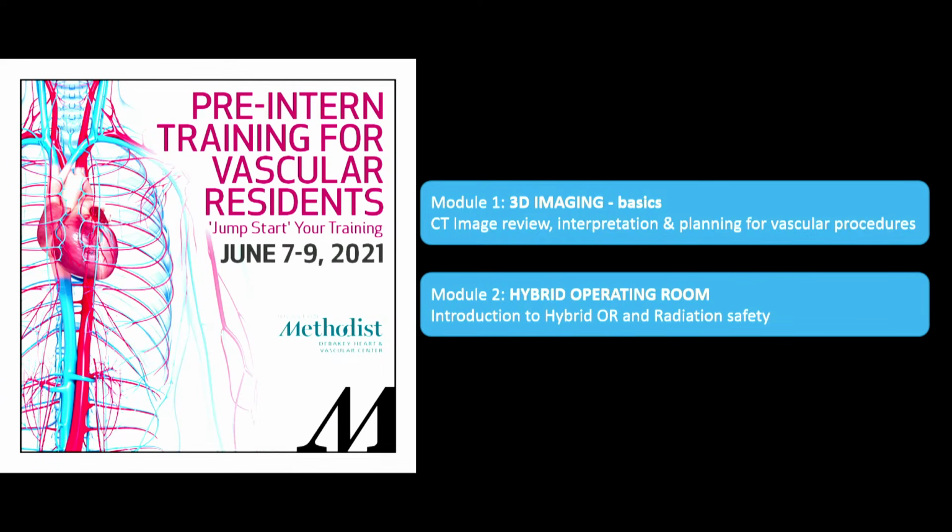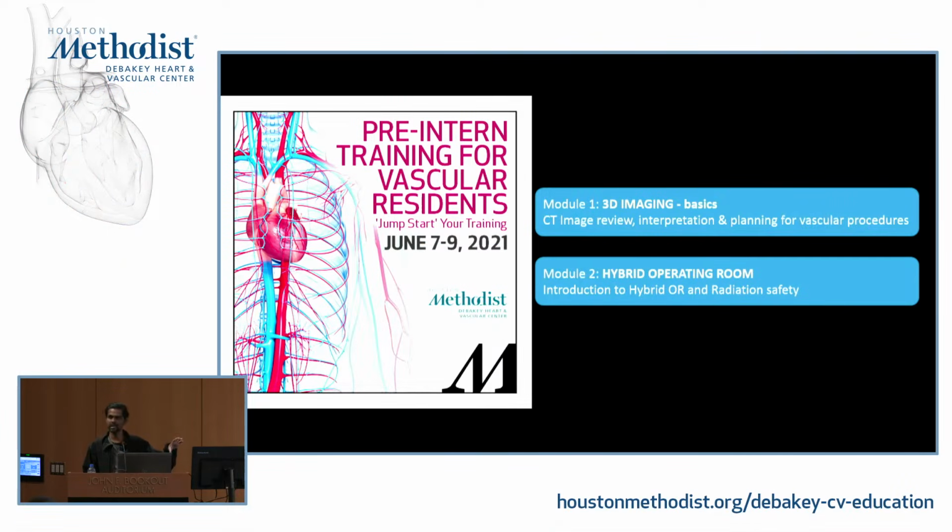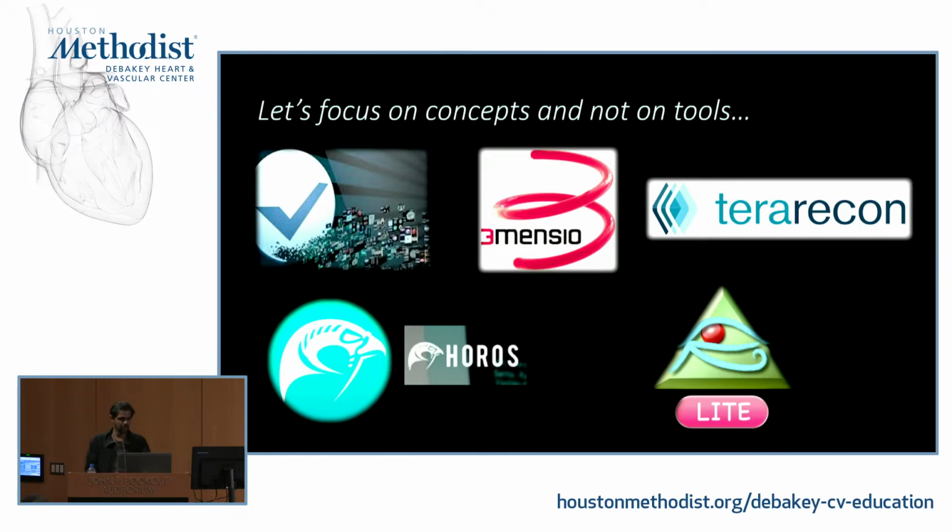I wanted to approach this in 2 different modules. Later this afternoon, you're going to rotate through the hybrid operating room, where we're going to touch on the hybrid OR and the radiation part of it. But the first part, which we are going to talk through today during the lunch session here, is how do we do basic CT review and interpretation.